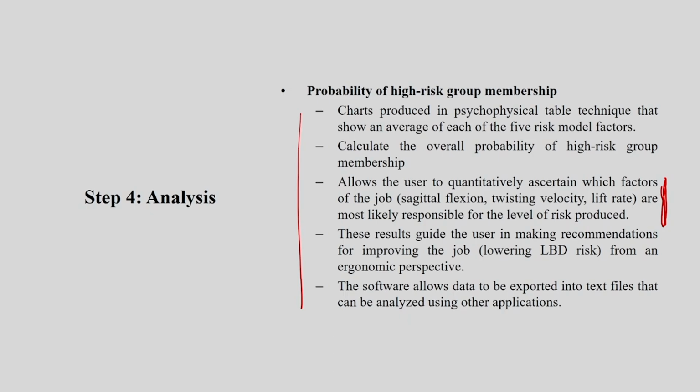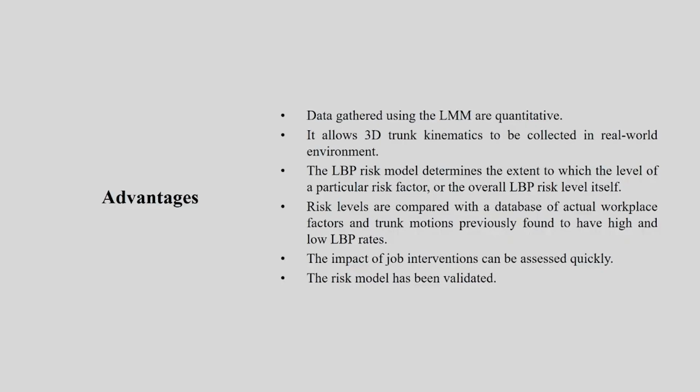The software also allows data to be exported into a text file that can be analyzed in any other application. So this is how you are going to get data, you are going to analyze it, and you can export it as per your requirement. Okay. Let us understand the advantages and disadvantages of this particular instrument.